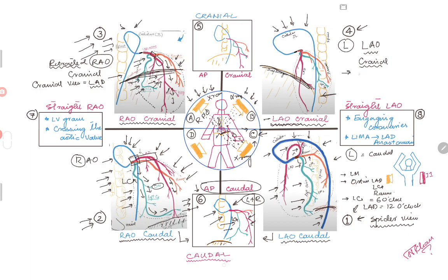The LAO cranial view is good for the LAD since it's a cranial view. The artery very obvious in the middle of the screen — going around six to seven o'clock — will be your LAD. This view is good for the LAD plus diagonal branches, especially the ostium of the diagonal branches, where you can see stenosis or the origin of the diagonals. You can still focus on the left circumflex and ramus intermedius, but they will be foreshortened and may have some overlap.